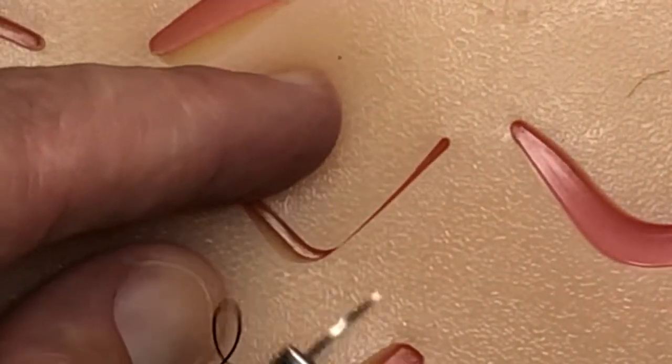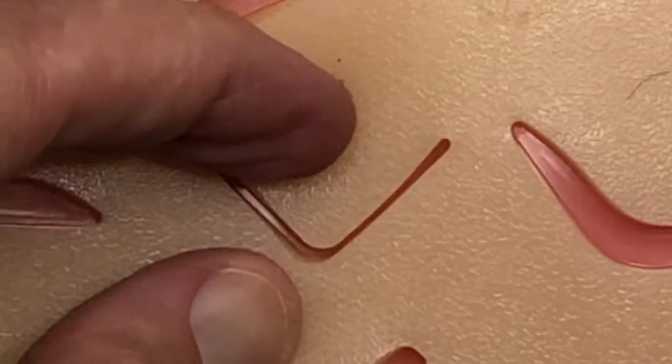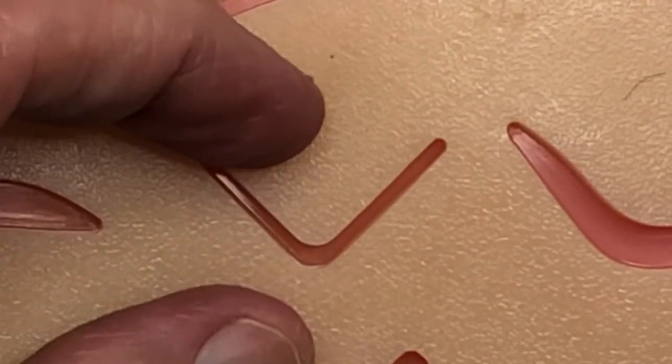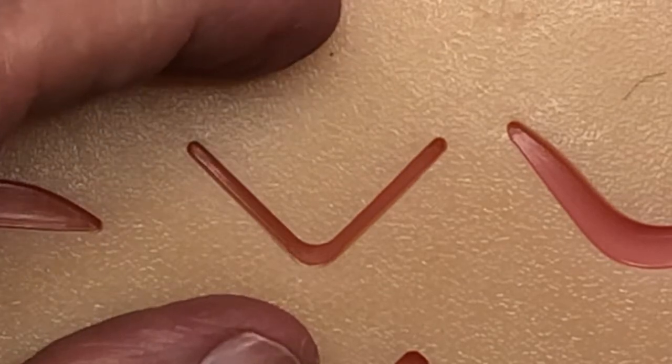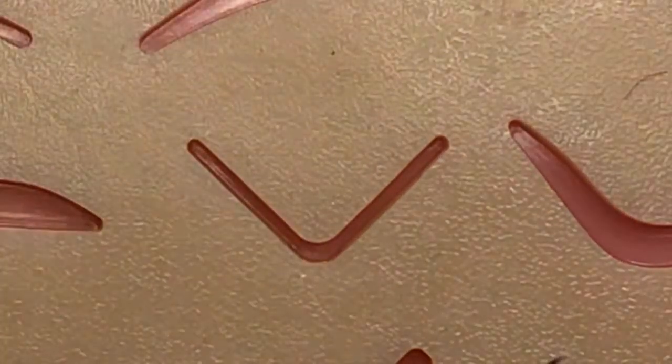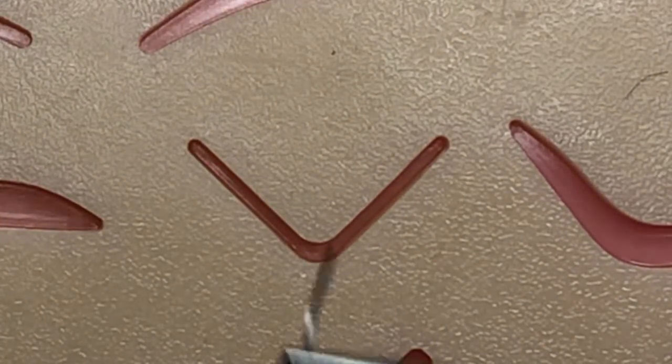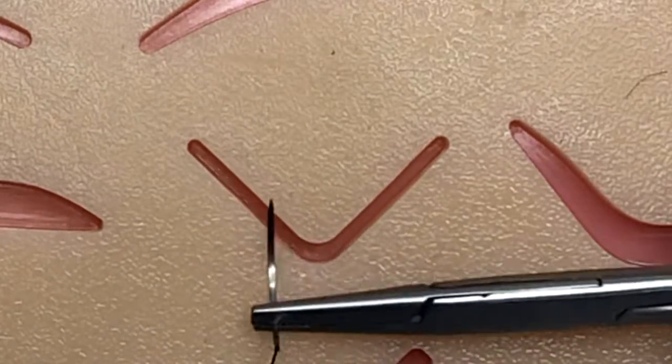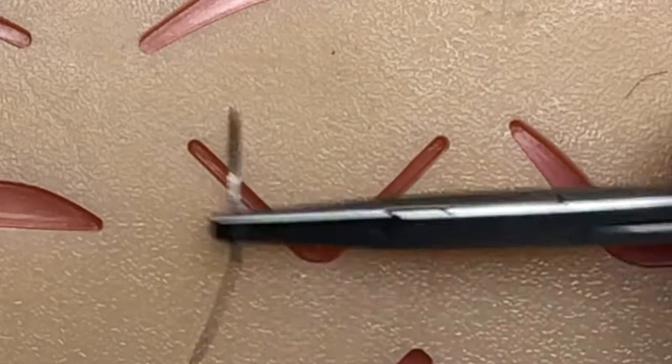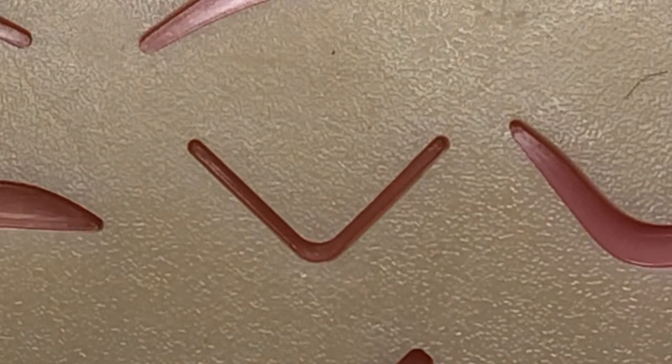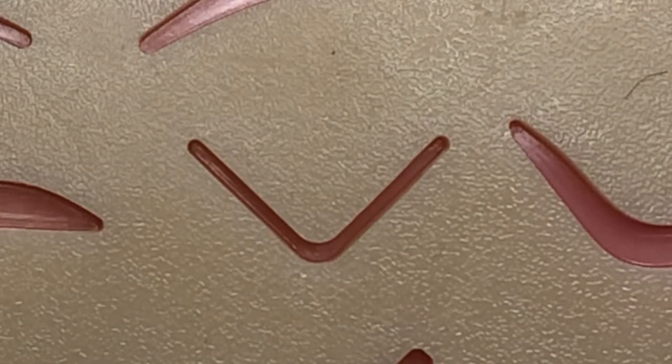And then lo and behold, you're going to get at the end and it's going to be off-center, offset. You're going to have unequal links of laceration and tissue to deal with. So I think that if you put your first suture down here in the middle, right at the apex of the wound, you're going to have a better end result and a better end outcome.